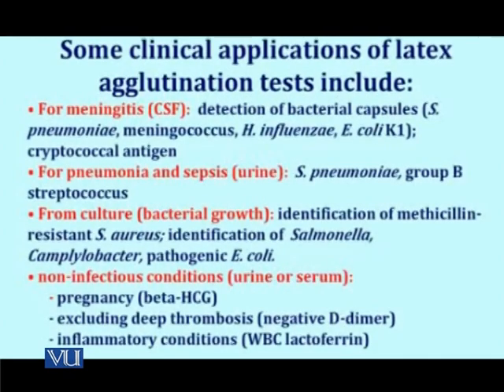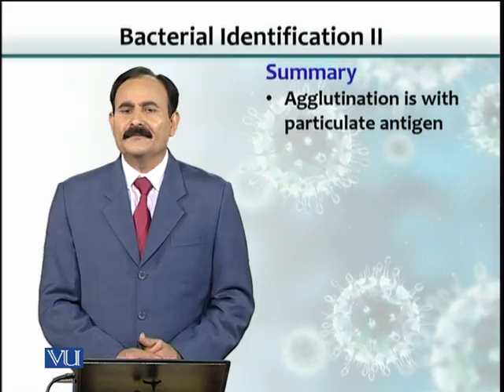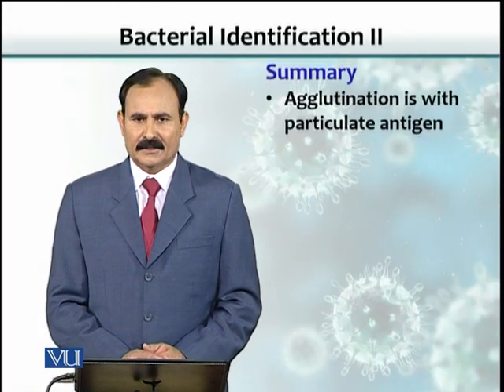Finally, here are some examples of agglutination assays that are used in clinical practice. In summary, agglutination is one of the serological methods that could be employed for bacterial or microbial identification.